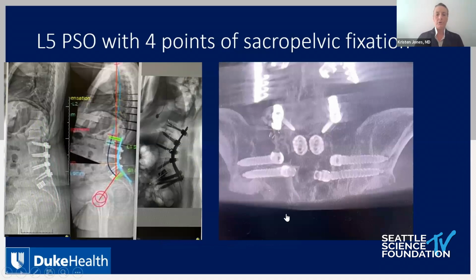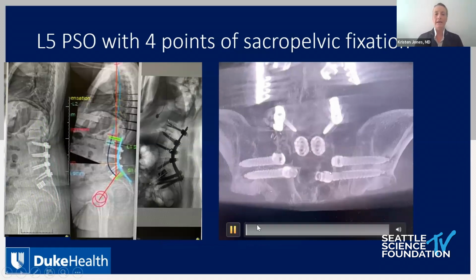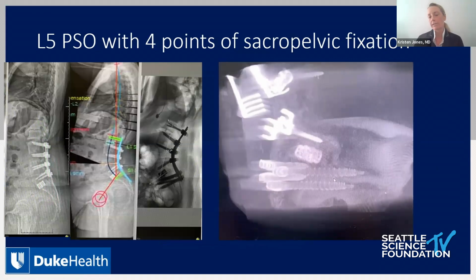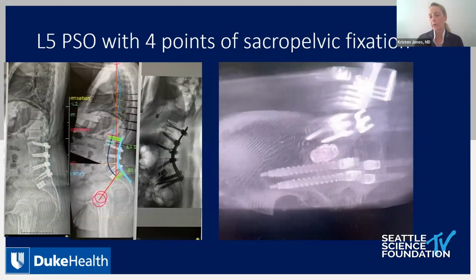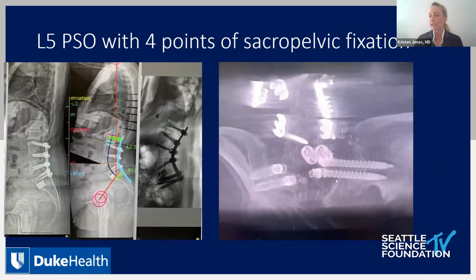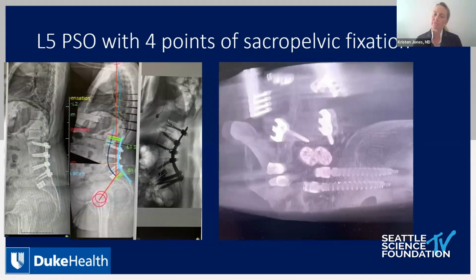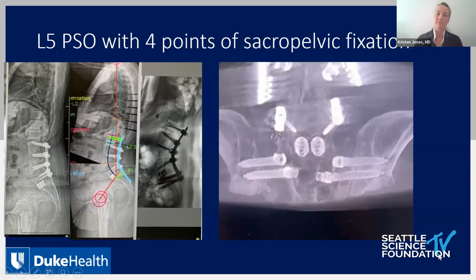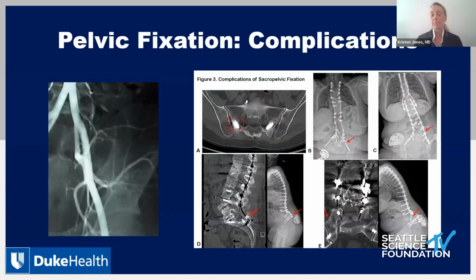And then, I think that when you are considering what exactly the patient needs, I can't tell you that using 4 screws that cross the SI joints results in a superior outcome. But just like Dr. Islak mentioned earlier, I think there is some consequence of ignoring the SI joint entirely as far as pain. And so all of us have patients who have done really well and we've never thought about their SI joints and never need to. But I think that on average, the amount of strain we're putting on the SI joint is significant, and I think we don't understand completely the consequence of that as of right now.